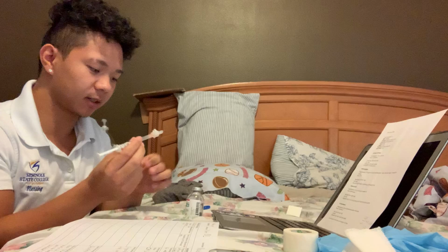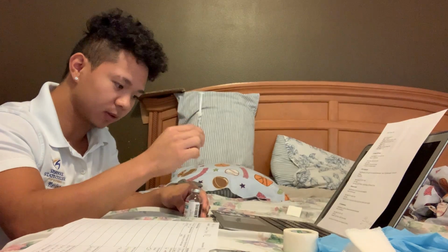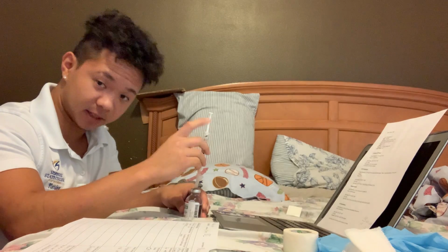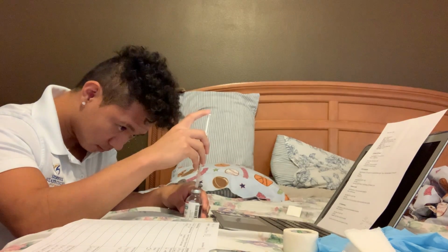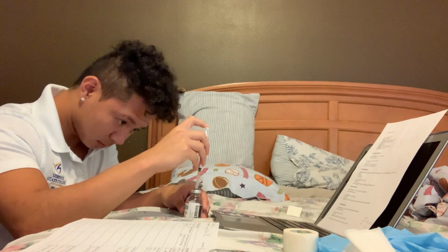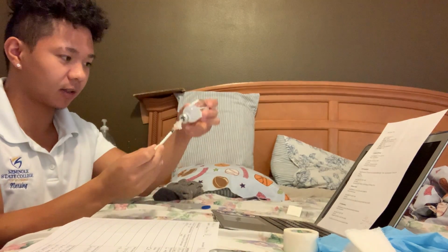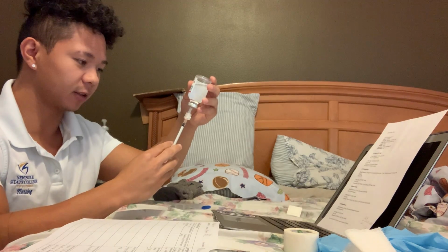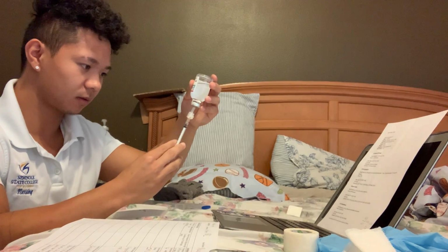And now I'm gonna insert it into the center of the rubber stopper, and I'm injecting the air. And now I'm just gonna invert it, and I'm gonna withdraw 0.5 milliliters of the medication.